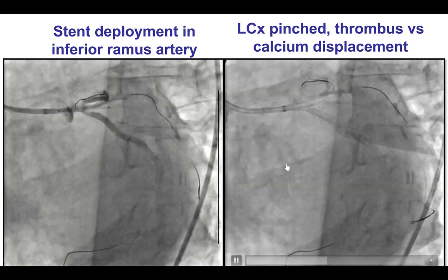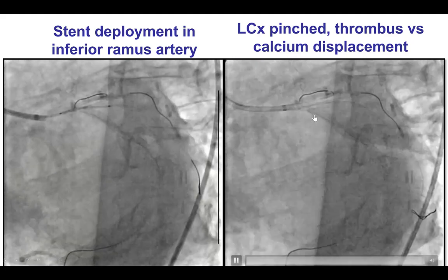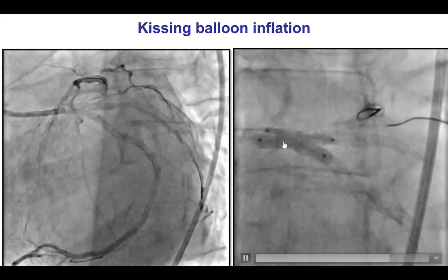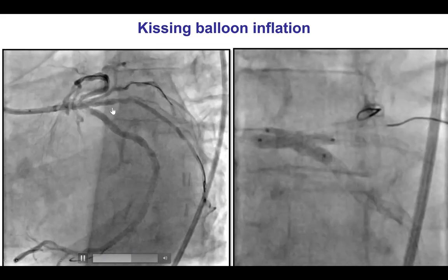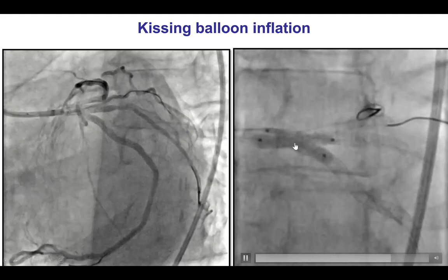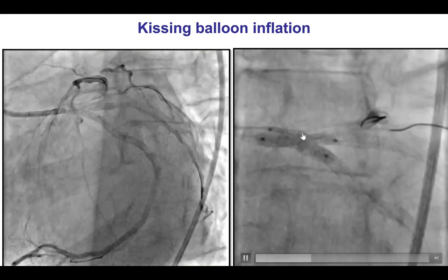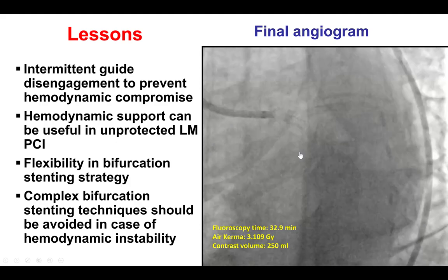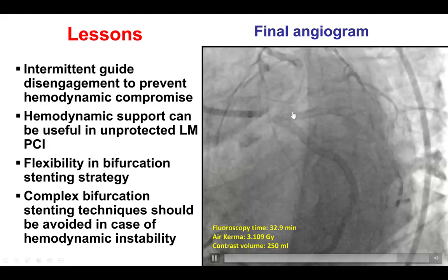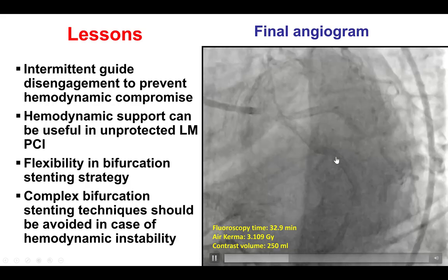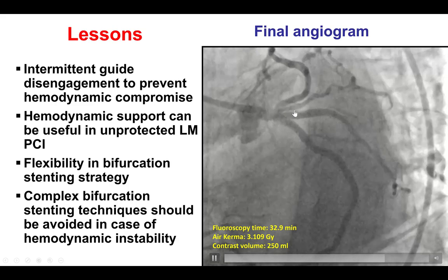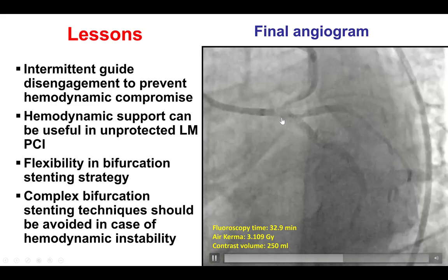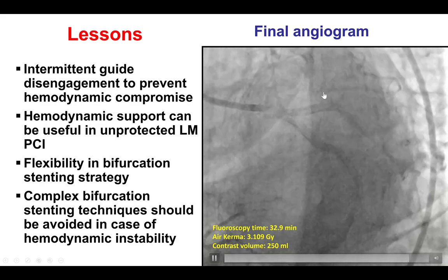However, there was some pinching of the ostium of the circumflex, either due to calcium or due to thrombus. We were able to rewire and then performed multiple high-pressure balloon inflations, including kissing balloon inflations. We did perform intravascular ultrasound, which showed that the lesion had subsequently expanded. A nice final result was achieved with TIMI 3 flow in both the inferior Ramus and the circumflex. The LAD and the superior Ramus did not have any significant compromise, and therefore we did not perform any additional dilations or treatment in those vessels.